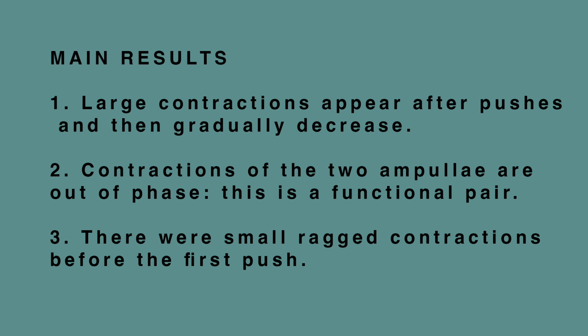In addition to these obvious features, the tops of peaks are broad and mostly flat, with a hint of small, fast oscillations. Finally, the peaks after a push are delayed by about 20 seconds, the length of the push, relative to the normal period of the contractions. Of course, you can't see this on this graph.